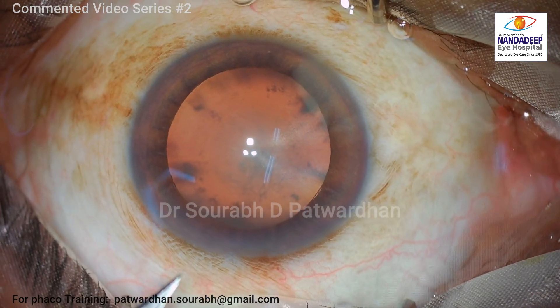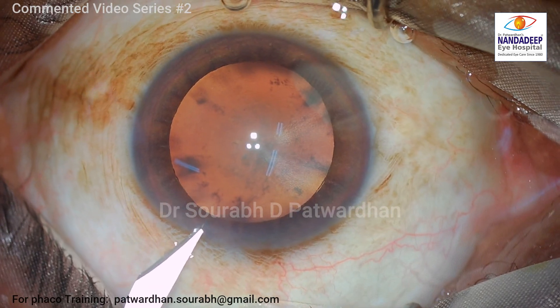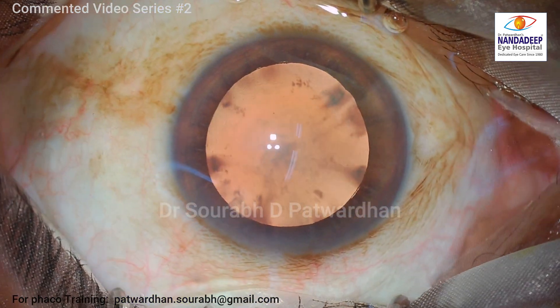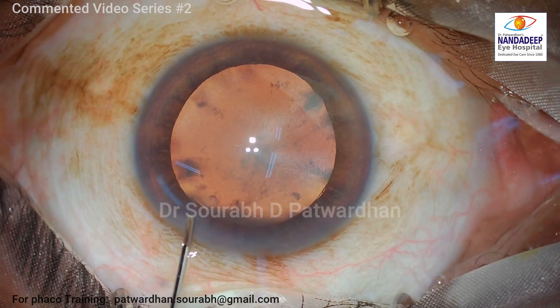In this video, I will be dealing with a peculiar case — a young patient, 45 years old, whose cataractous lens is just 3.2 millimeters thick.